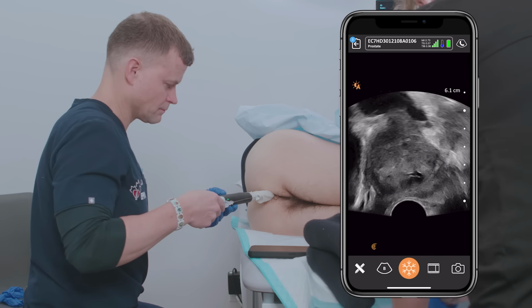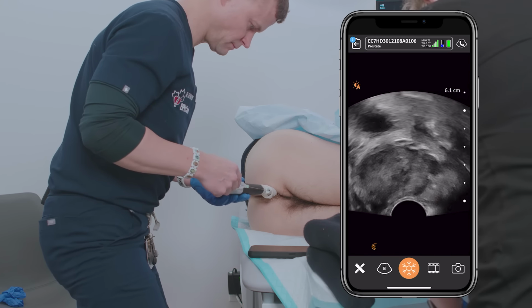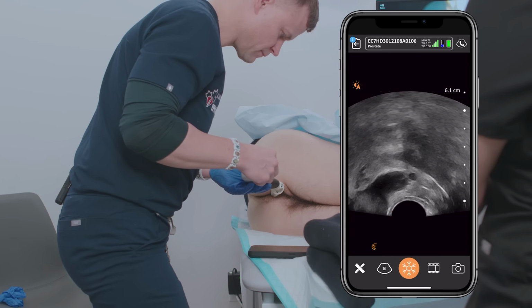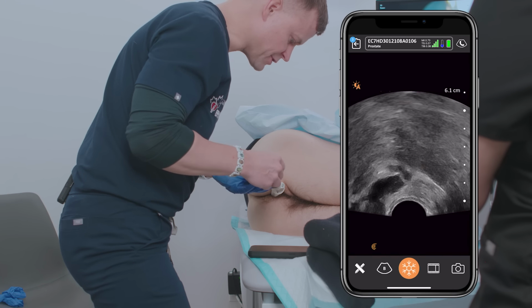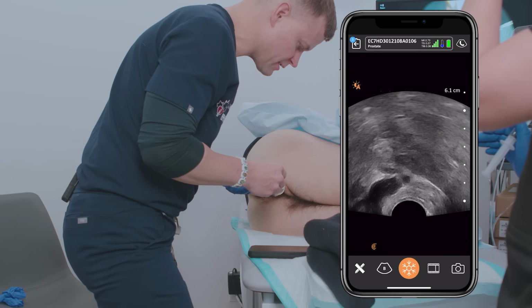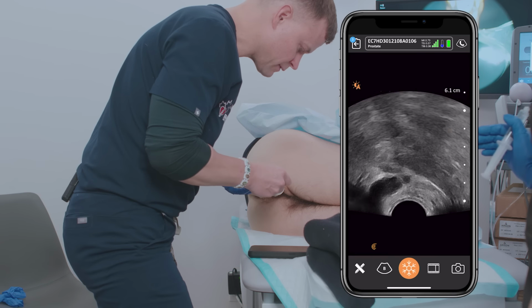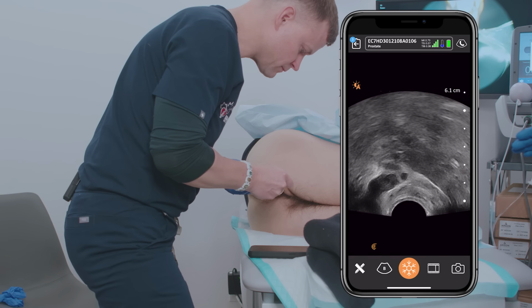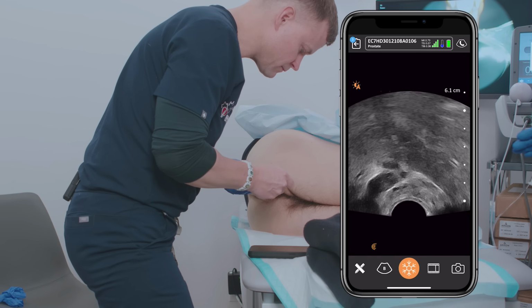At this point, using a sterile accessory troker attached to the probe, we can introduce our long needle into the fossa and deliver our 5 cc's of lidocaine beneath the seminal vesicle, the standard location for our periprostatic blocks, keeping in mind not to enter any vascular structures.